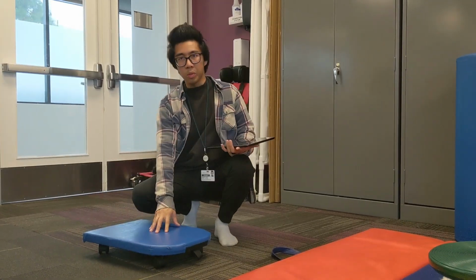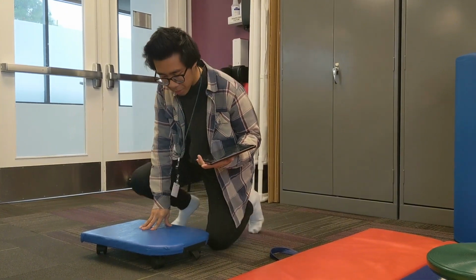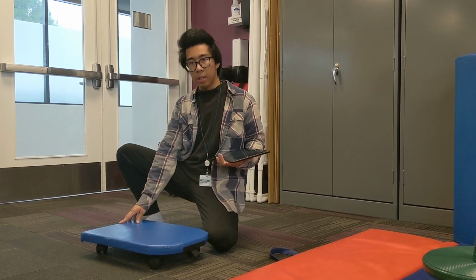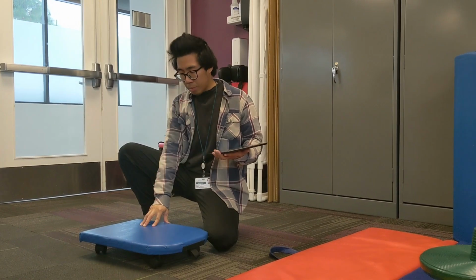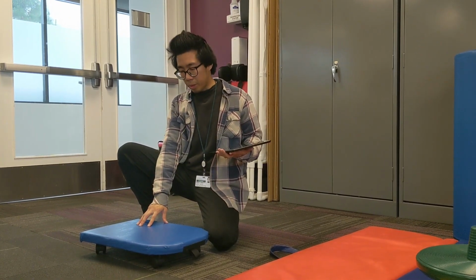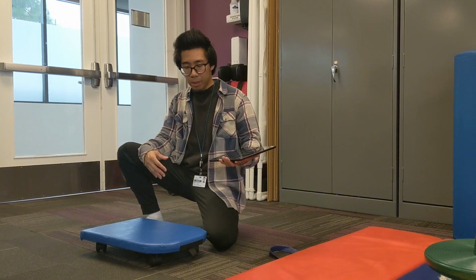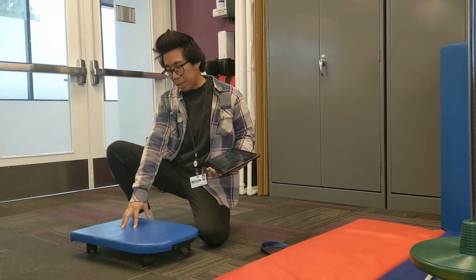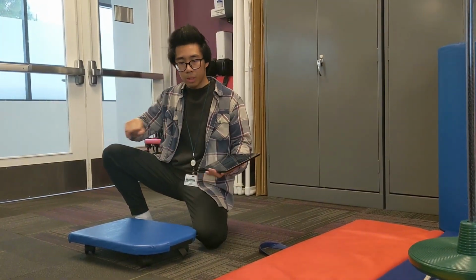This is a prone scooter board. As Dr. Gatman mentioned, the therapist would want to be positioned with one knee by the caster at the front, the other knee by the end, and then hand by the child using contact guard assist. The primary purpose of this prone scooter board is to once again provide that vestibular input, that proprioceptive input, once again that motor planning, having the child problem solve on how to get on, get off, what body parts to move, what objects they could pick up, what sequences they could follow.